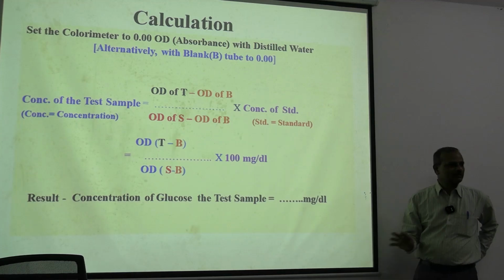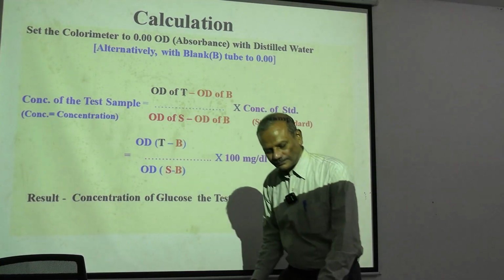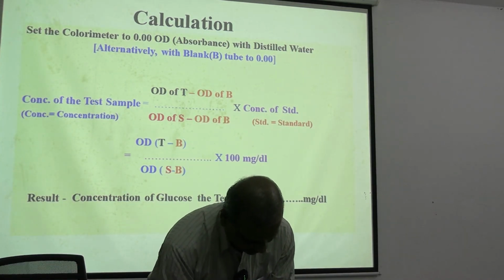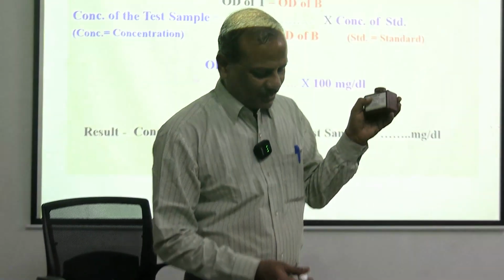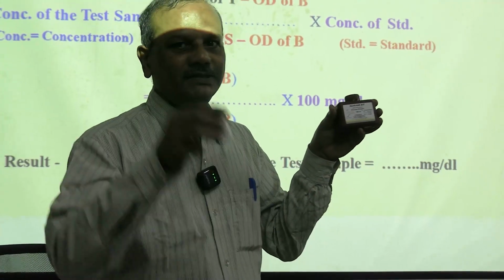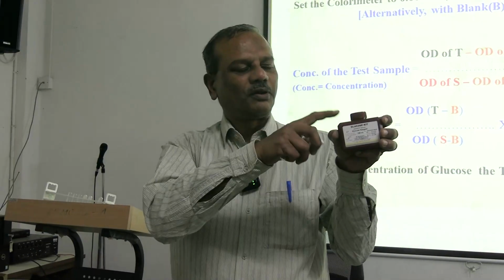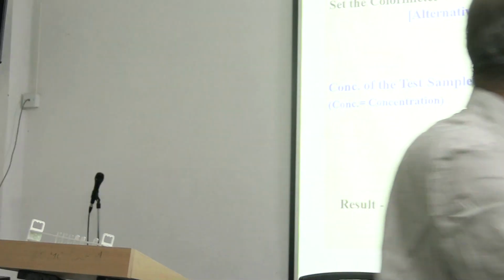Now, what is the magic in it? That is what I am now trying to explain. Now, there is a reagent in the box. So this is the reagent, and this is the standard, 100 milligram. From here you will open the cap.